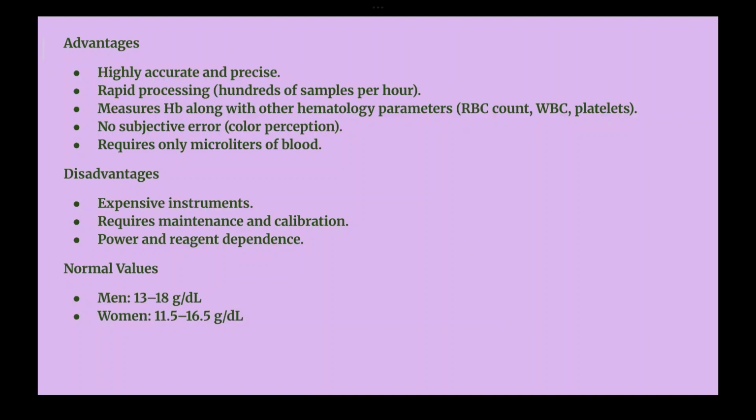It requires only a few microliters of blood and does not require an excessive amount of blood. The disadvantages are that it is an expensive instrument, and it requires maintenance and calibration every week or monthly. It requires power and reagent dependency as well.